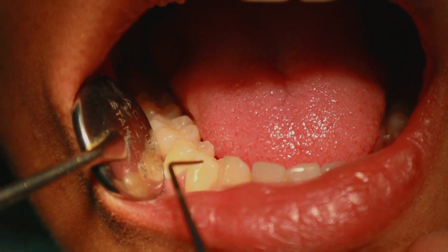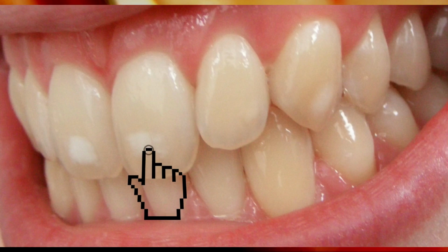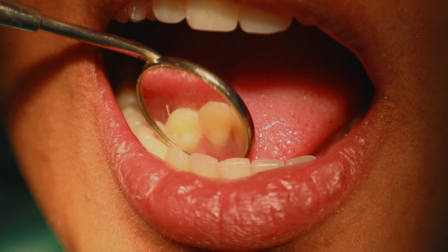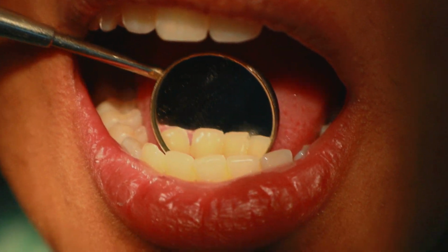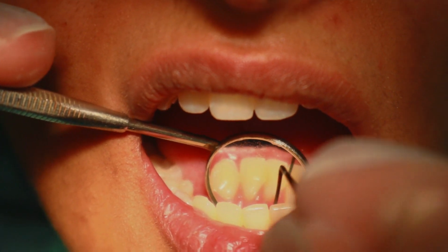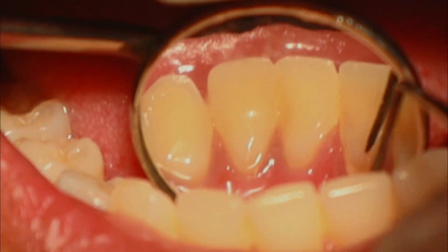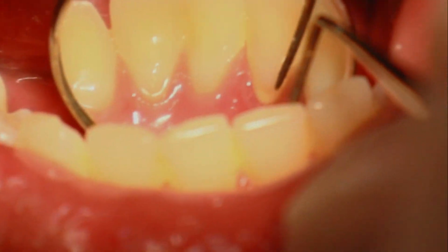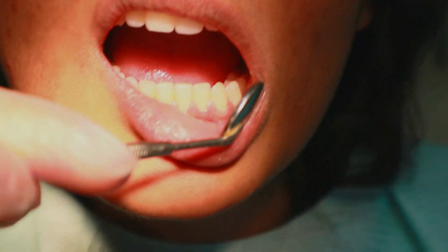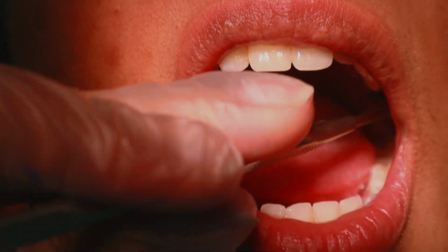So on 4-4 right here, there's a little white spot, and that is actually just fluorosis. It's caused by fluoride ions, and it's perfectly normal and healthy in your teeth. It's just caused by too much fluoride ions. It could be in the water, in the toothpaste, and whatever. I see a bit of calculus here, between these teeth and back here. You can see it in the mirror, on the lingual surface of 3-1. I don't see any problems there.